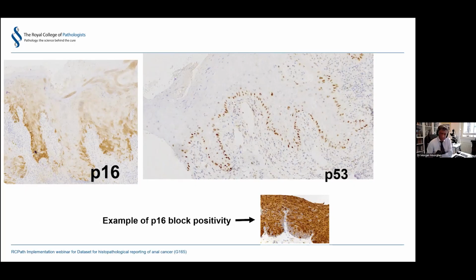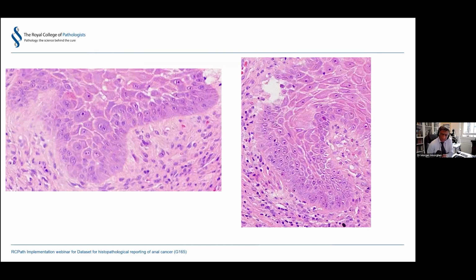The other thing, because I took the picture, and so Newton is at a slight disadvantage here. If we go back to the H&E, the basal atypia which is described in that condition, they say you get dysplasia, you get atypia, which is sometimes like a BCC, basaloid type with spindle-shaped atypical cells, but you can also get a form of atypia which looks like that, where it is epithelioid, where your nuclei are showing a vacuolar or vesicular change, and then the nucleoli really hit you, and they do here.